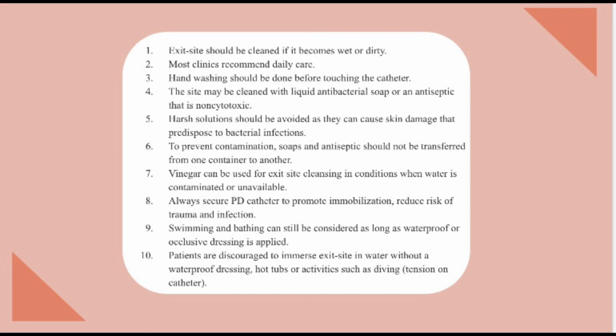Always secure the PD catheter to promote immobilization and reduce the risk of trauma and infection. Swimming and bathing can still be considered as long as a waterproof or occlusive dressing is applied. Patients are discouraged from immersing the exit site in water without a waterproof dressing, using hot tubs, or doing activities such as diving because it creates tension on the catheter.